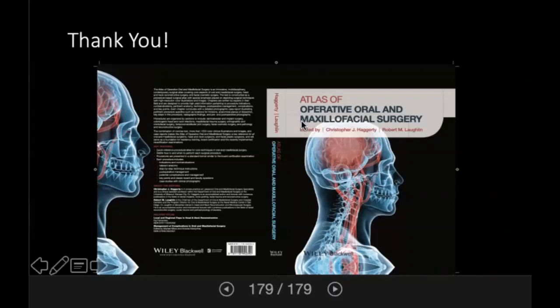If you have a really, really long locator abutment, then that's going to create a lot of torsional and bending forces on that locator abutment that can cause the implant to fail. It's also going to really wear out your locator housing and your locator retention ring. So you really want about 1.5 or 2 millimeters above the tissue to prevent those abnormal bending and torsional forces.